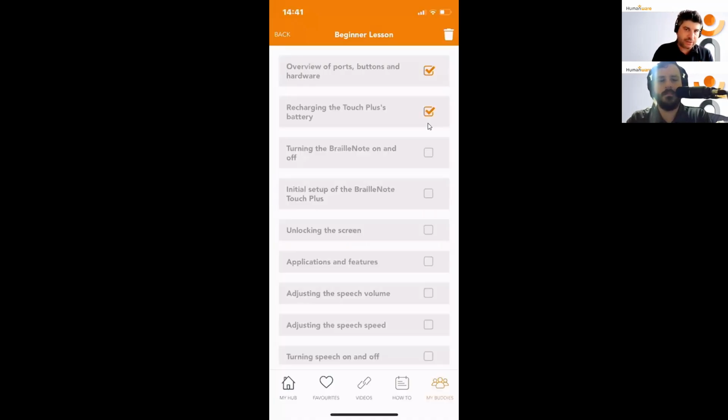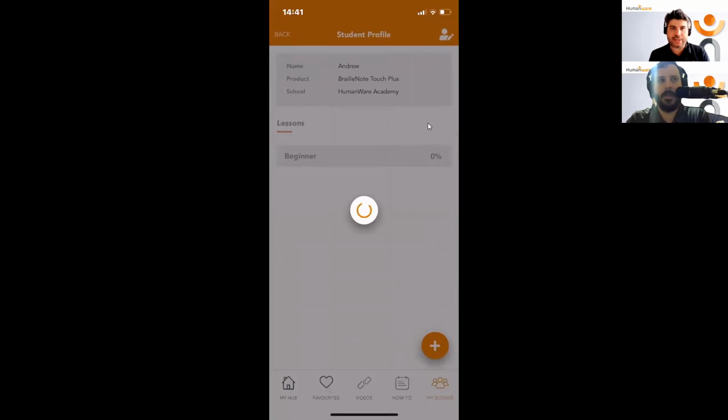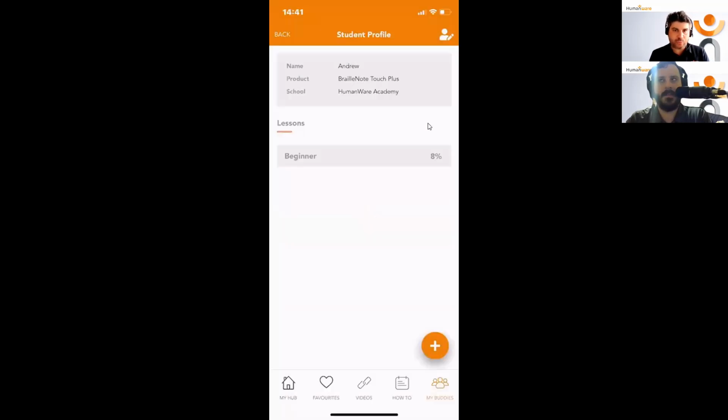And I'm just now going to take us back to my lesson plans. We can now see that the percentage has changed to 8%. So Andrew is now 8% through the beginner's course.